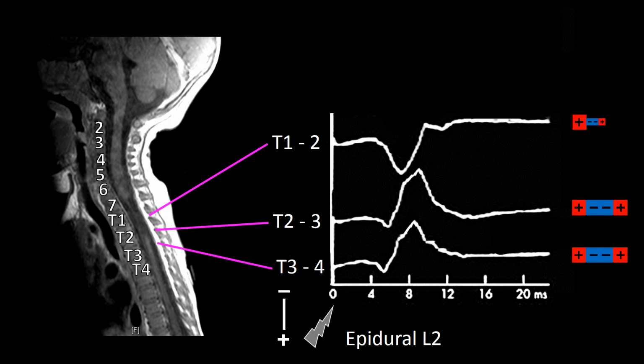The explanation for this pattern is that at this point only the positive field of the trailing dipole is capable of generating a healthy potential, since the rest of the quadrupole is already in the damaged area. In this frame, I have placed the quadrupole in the spine to make it clearer. It is important to stress that this explanation has many holes, but it is a good way to remember what actually happens.